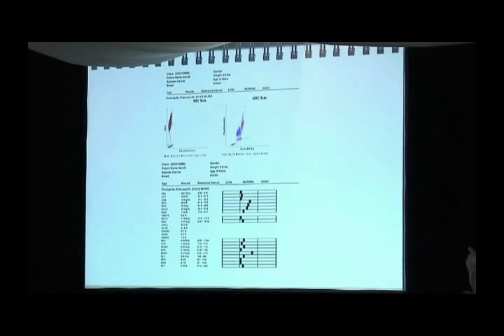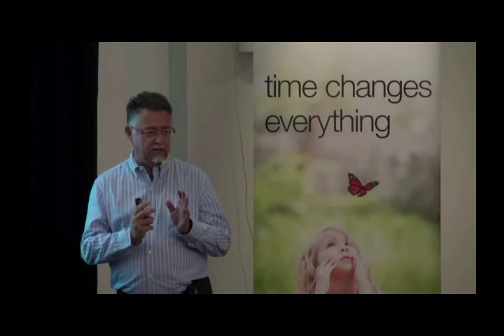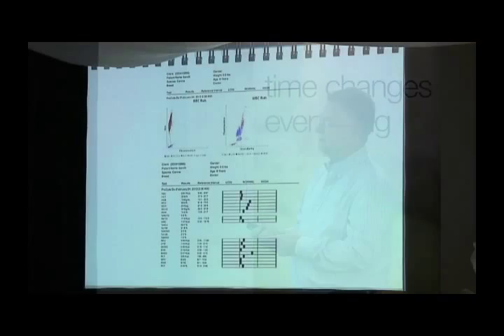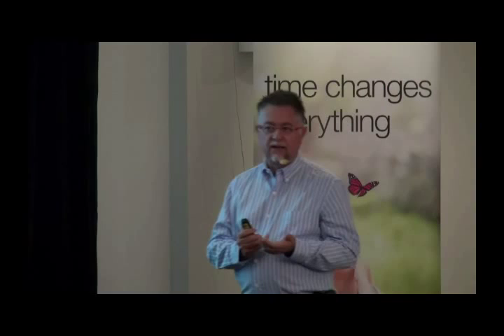So I would really like for the dot plots to come out like this, because to be honest, I do not look at the numbers until I look at the graphics, all right? Period. That's the way it is. So I look at the graphics first, and then I get a better idea from looking at the numbers. And I'm going to tell you in two slides how these graphics are generated. They are easy to understand. There should be very low mortality through the two slides. Most of you should remain alive and well. And it's important, again, if you have a hematology analyzer, to know what their limitations are, isn't it?